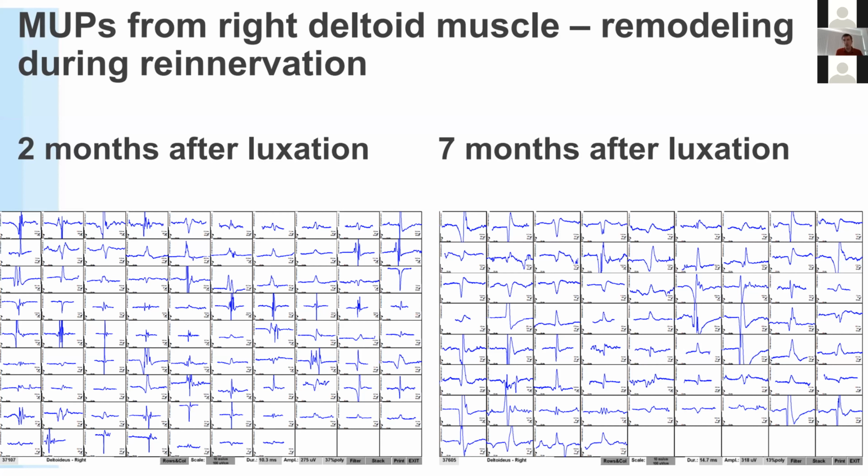So in semi-quantitative multi-MUP analysis, the software algorithm filters individual motor units out of a richer contraction pattern. And this is an example where we ask the patient to contract the right deltoid muscle, and the algorithm of the program software filters the different motor units itself. At the end, the mean of the metric values of amplitude, duration, and polyphasic patterns are automatically calculated.